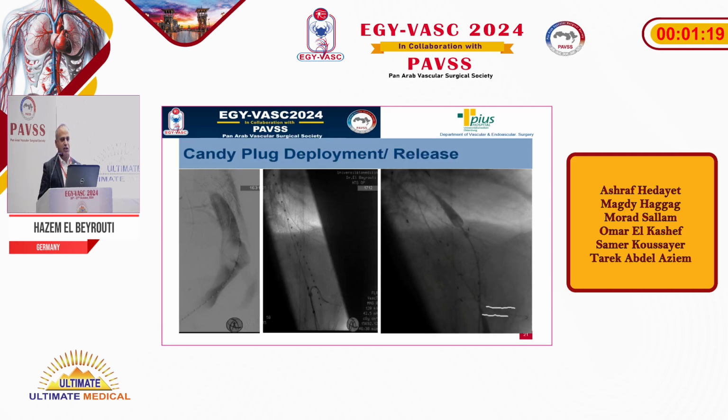After cannulation of the celiac trunk, to prevent complications such as occlusion or migration of the candy plug, I put a wire in the celiac trunk.